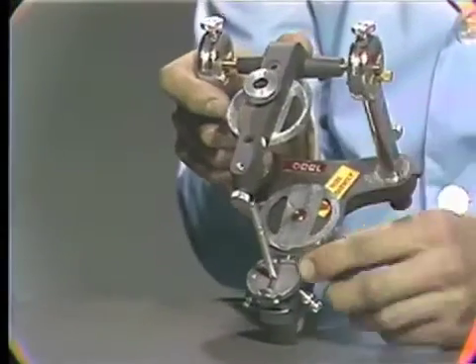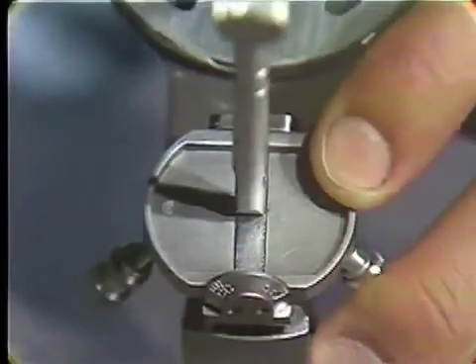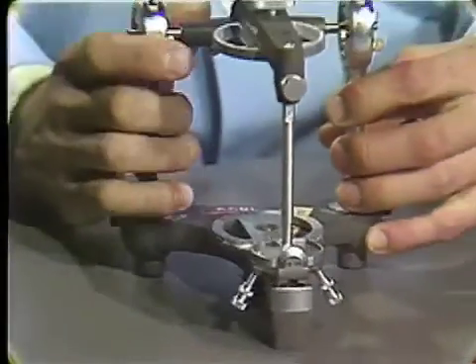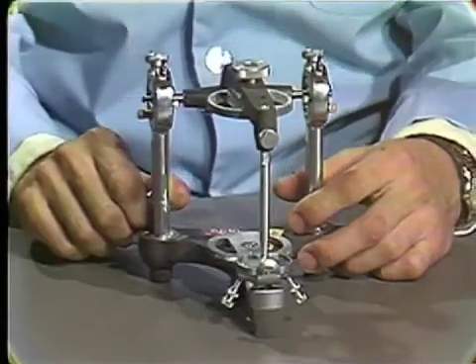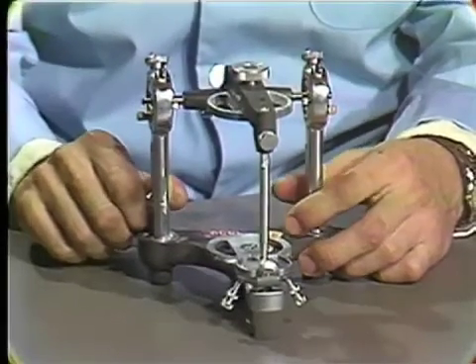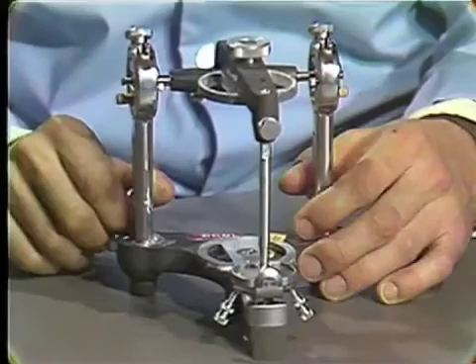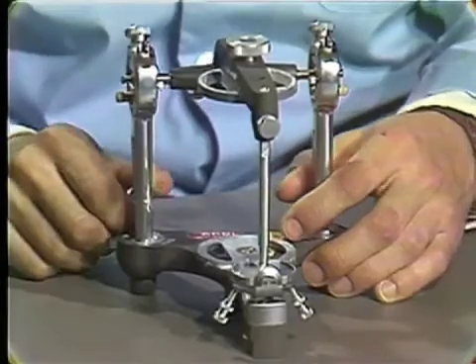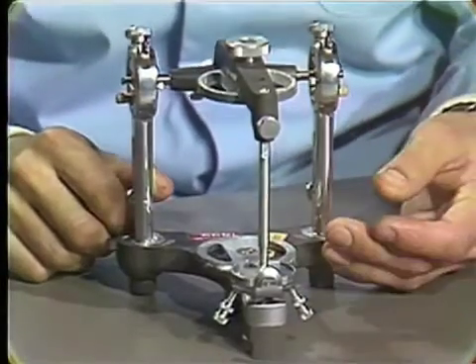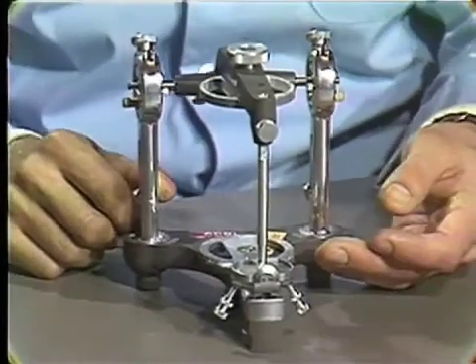Now one would check to see on the incisal table again if the pin was centered down here on the table and if no movement from side to side is possible. Then the articulator can be set at whatever settings you would like to use for your patient, and you can be assured that the articulator, when closed in centric relation with the balls of the articulator locked forward, will be in the same position time after time. It is important that this be done before any cases are ever mounted on the articulator issued to you, because if you mount a case on it and then find there's a certain amount of slop, the case has to be remounted after the articulator is re-zeroed.